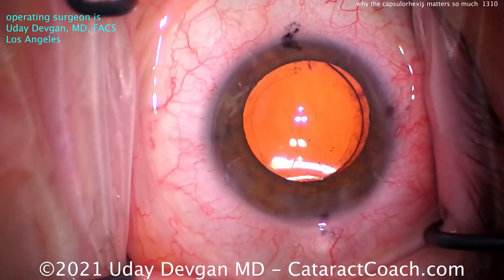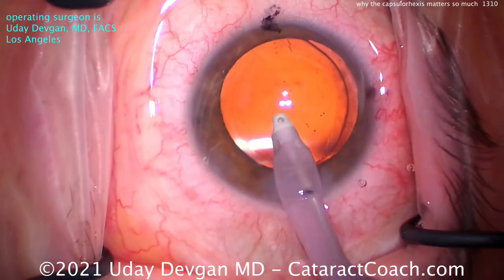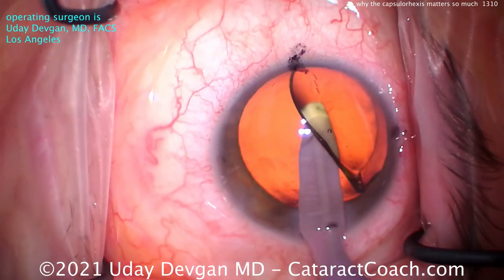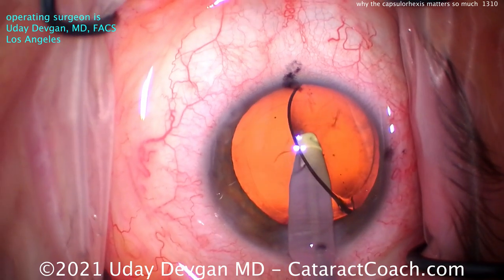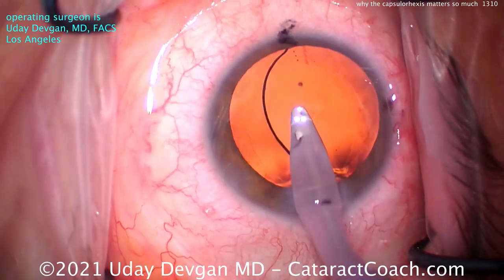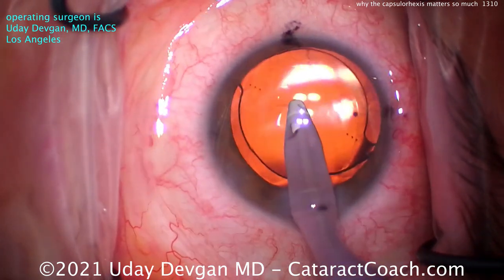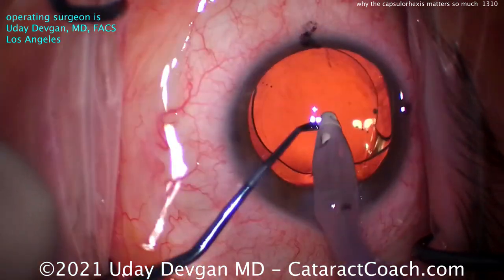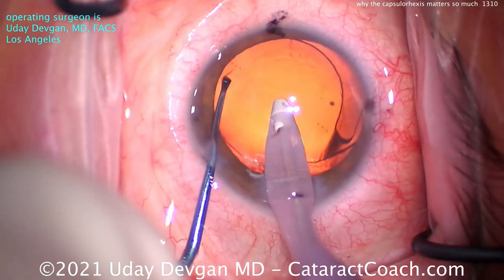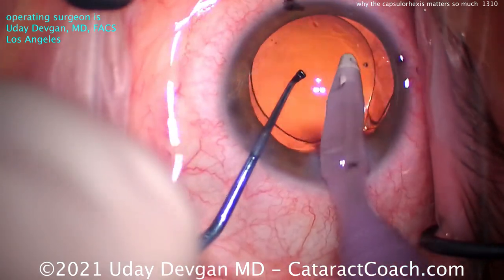They're going to line that up with the toric IOL marks. And that's also why we made the incision on that steep axis, so that we don't change that resultant astigmatic axis again. So we want all the viscoelastic out from behind the IOL — especially with the toric lens. I want that posterior capsule to be in direct contact with the back surface of the optic. And now we can dial this lens into position. This is also the reason why you want to have that rhexis well-centered, because we're going to rotate this lens and get it into position.